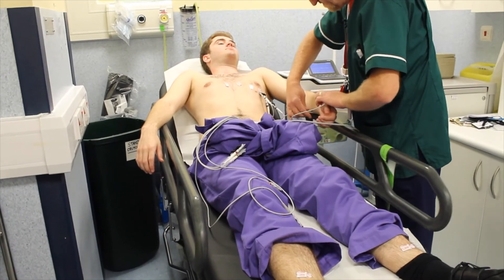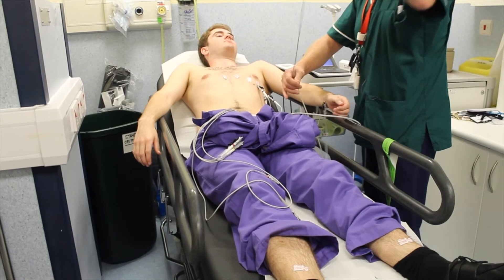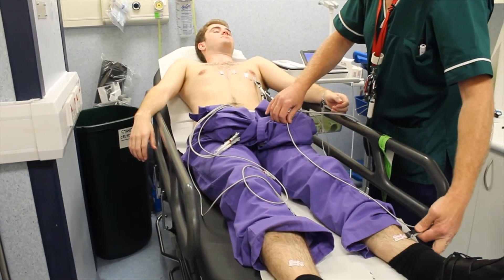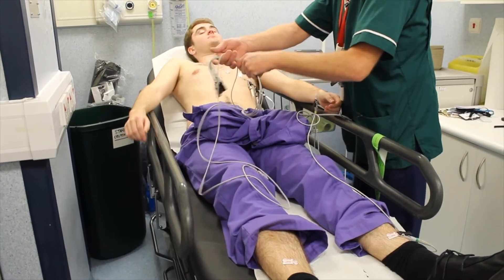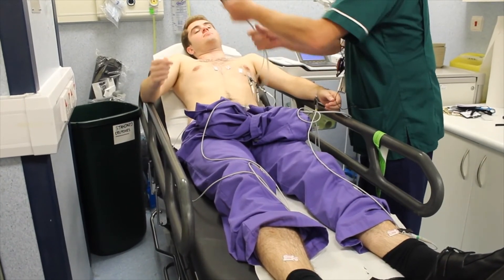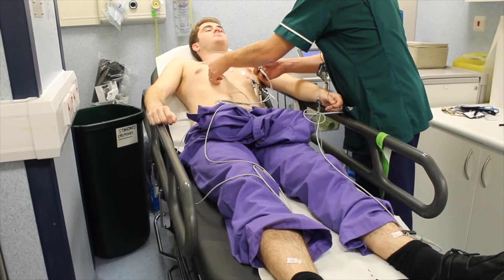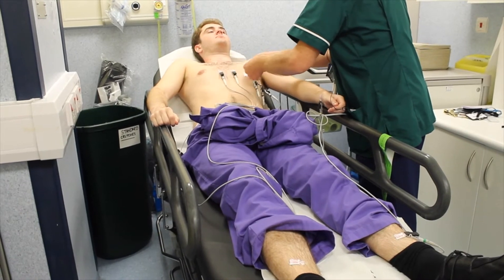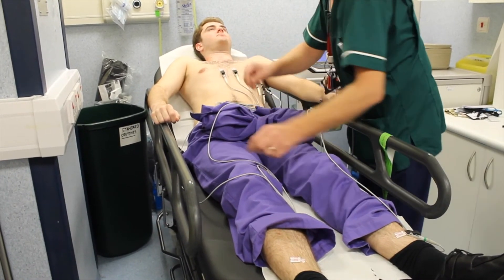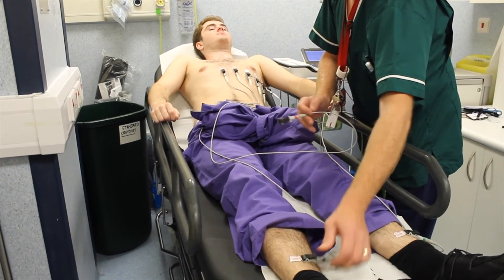Yellow to the wrist. Green to the ankle. Red number one, yellow number two, green number three. The last two leads: black ankle, red.